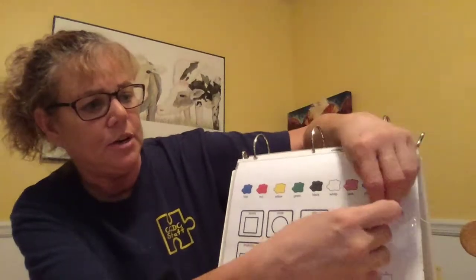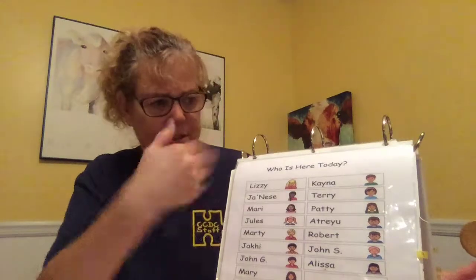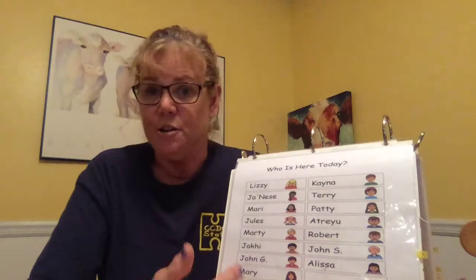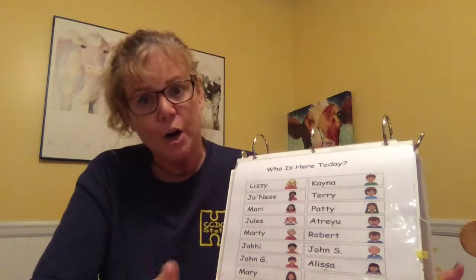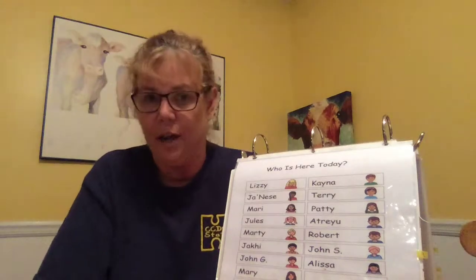The other page I set up in here was for morning meeting, like under the language arts section from the table of contents. I kind of envisioned John using this with a peer communication partner, especially for the attendance piece. Obviously, that communication partner, being a peer, would need to know what the movements were that meant yes or no, and I think that would be easy enough to teach even second graders. John's 7, first or second graders.